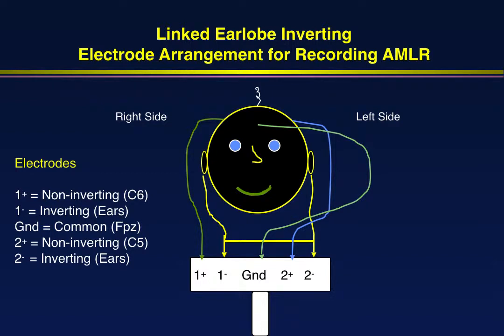You got to plug the electrodes in, of course, and each hemisphere electrode is non-inverting. But what do you do about the inverting electrodes? Well, there are two strategies, or actually three. I use a linked earlobe, so I've got an earlobe electrode, not a mastoid. Avoid the post-auricular area. A linked earlobe approach takes a little cable that connects the two inverting inputs, and then I put the electrodes from each earlobe into that cable, so I'm linking the earlobes.